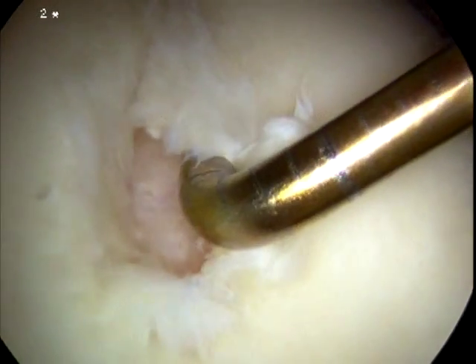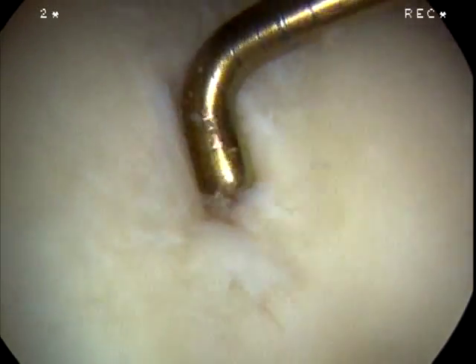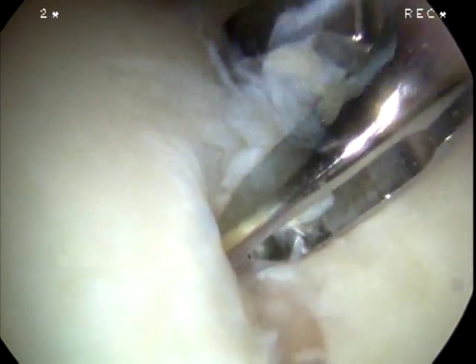Here the full thickness trochlear lesion is probed, flaps of articular cartilage identified, and the extent of the lesion fully understood. A biter is brought into place in order to trim the flaps back to a stable base.